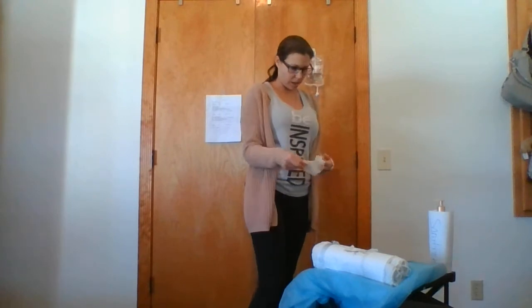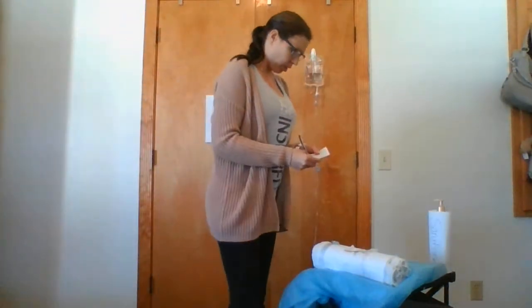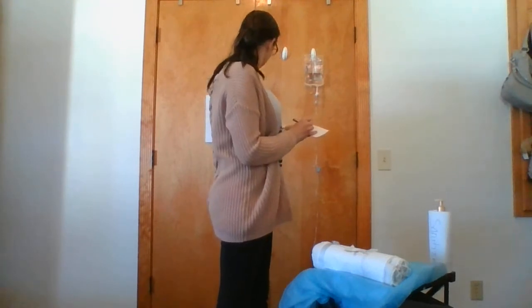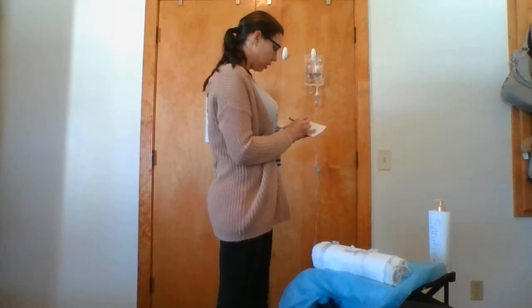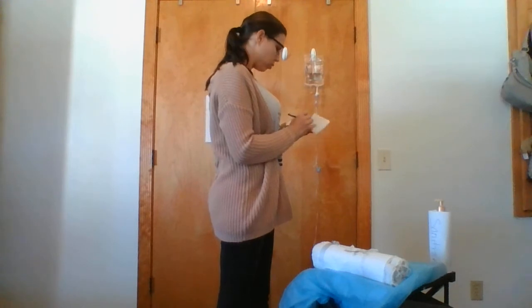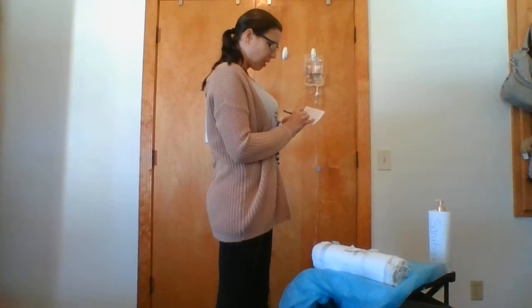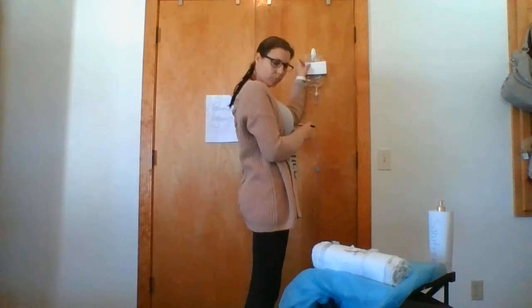When you're finished with that, you want to make sure that you label your tubing and your IV bag. So you're going to put the solution, which is the 0.9% sodium chloride, patient's name, which is Ellen Davis, the date, which is today, my initials, the prescribed rate, which is 125 milliliters per hour. The time I started it is at 12:55. It's going to run for 4 hours, and you can put the time end on there, okay? And you'll take it to your IV bag.